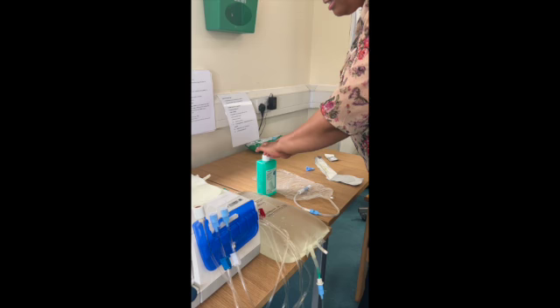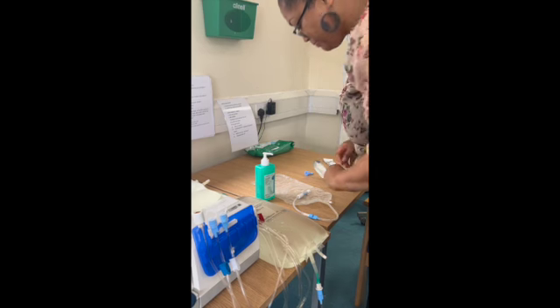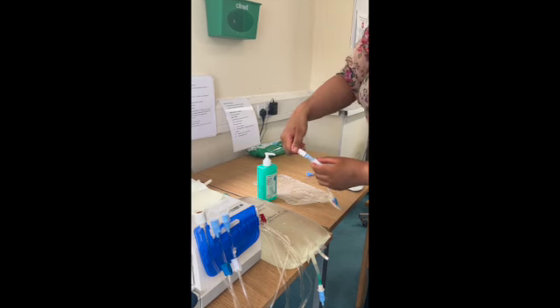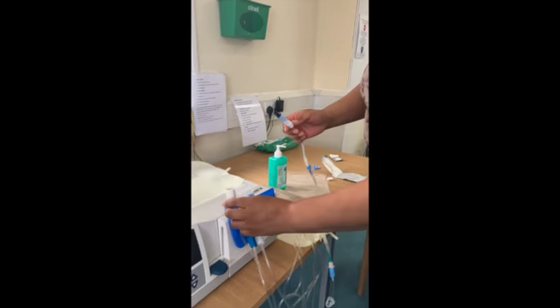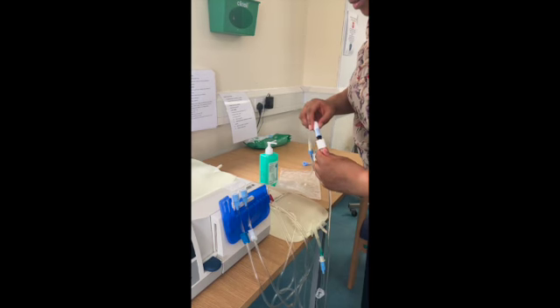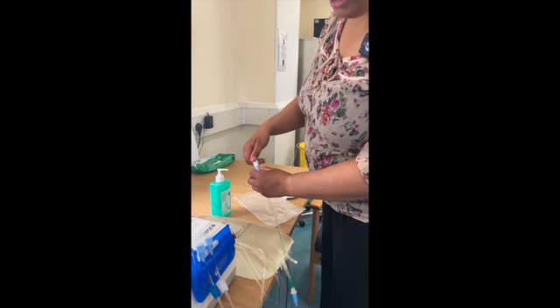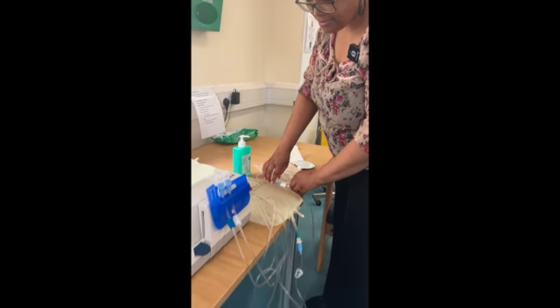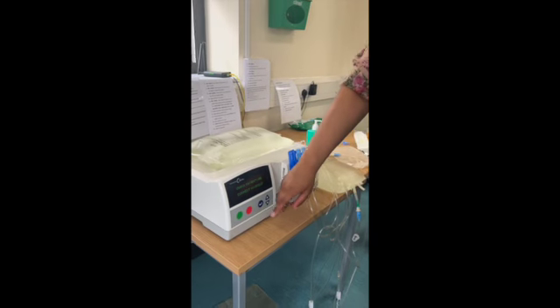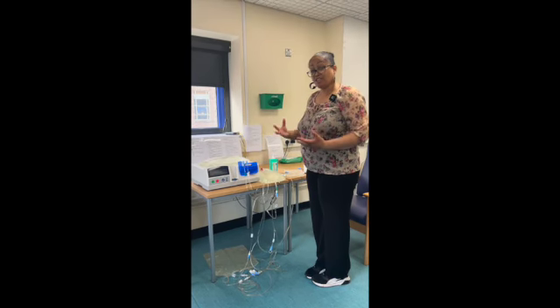So I'm going to gel my hands, and then I'm going to connect the catheter to the patient line. Again, being careful not to touch the inside of there to risk contamination. I'm now going to open the twist clamp. And then start the process. So now the process of dialysis has started.